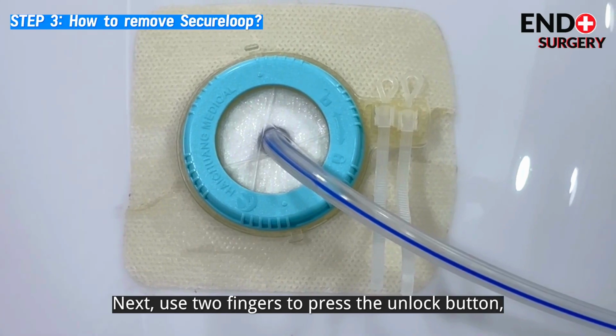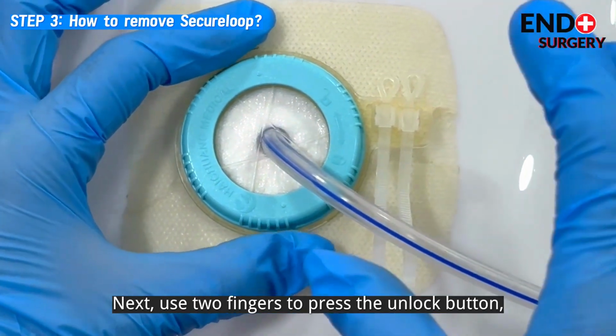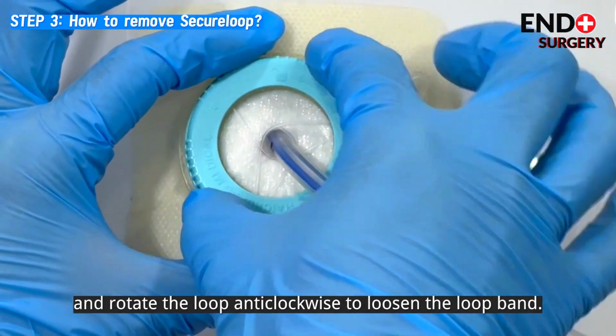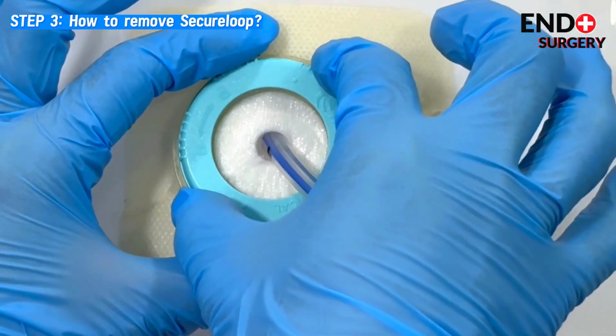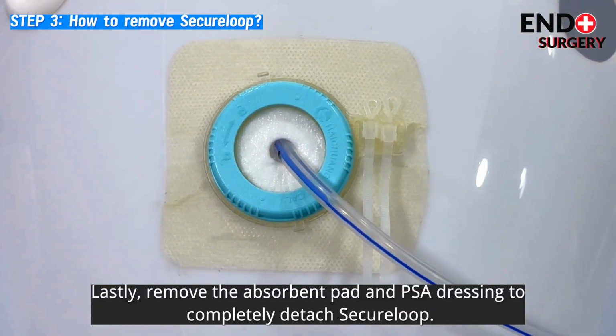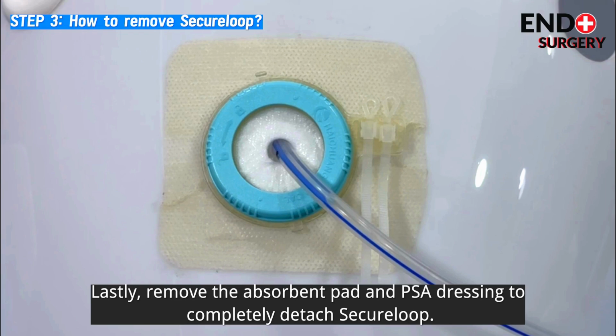Next, use 2 fingers to press the unlock button and rotate the loop anti-clockwise to loosen the loop band. Lastly, remove the absorbent pad and PSA dressing to completely detach SecureLoop.